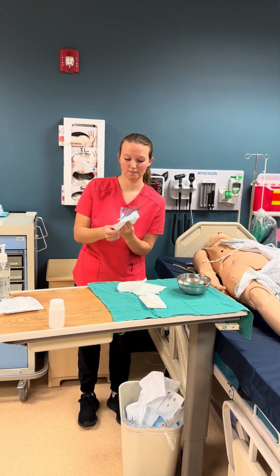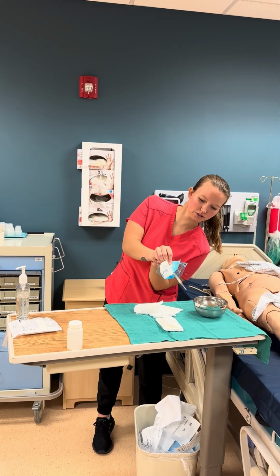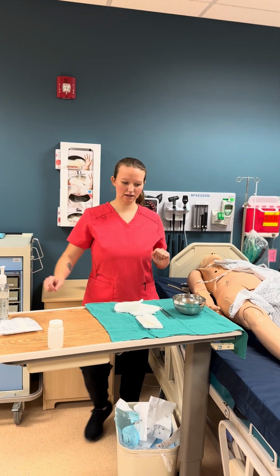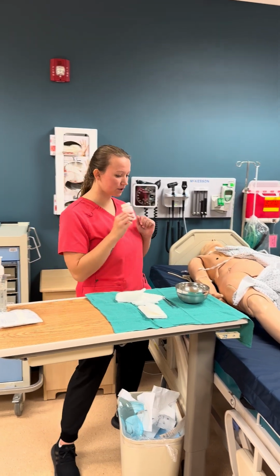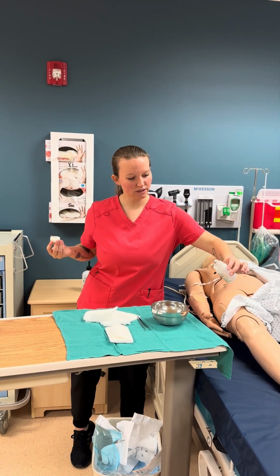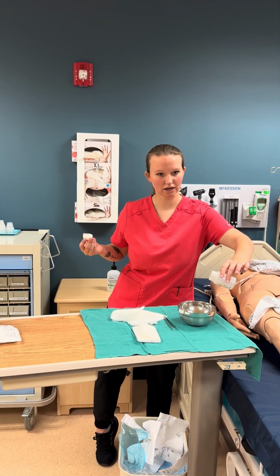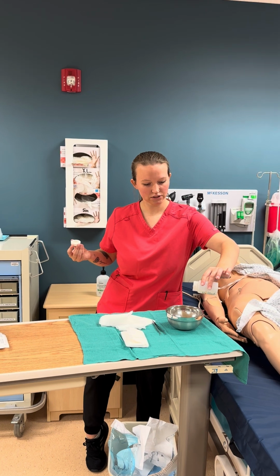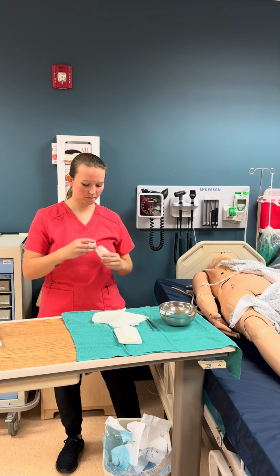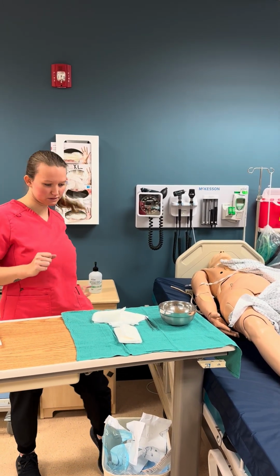Well, alright, remembering 1-inch borders. You have them on there. There we go. All right, and then I can go ahead and do the sterile water here. I'm gonna open up and away. I'm gonna keep it 4 to 6 inches above the bowl, and just remember that water cannot splash out. 4 to 6 inches. No water can splash out. Good. And then for the sake of this, I'm gonna recap it and put it on the table behind me since we reused them. So there's that.